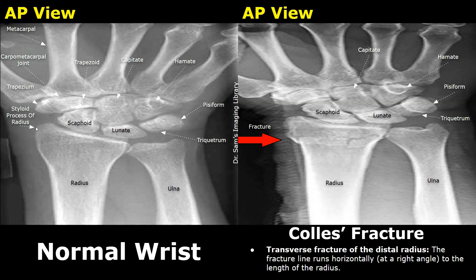The image on the right shows a distal radius fracture. A horizontal crack is present in the bone — this is the fracture line. It runs horizontally at a right angle to the length of the radius. This type of fracture is a transverse fracture.